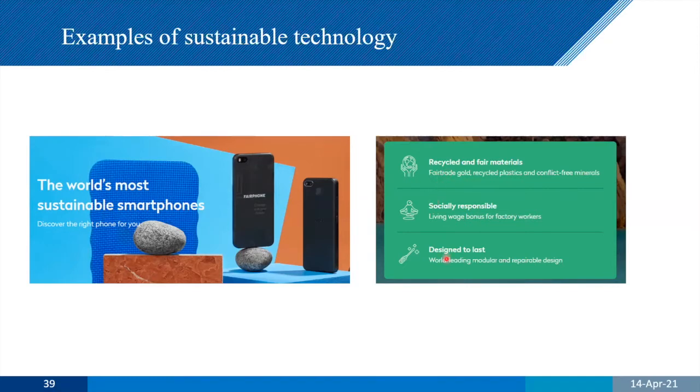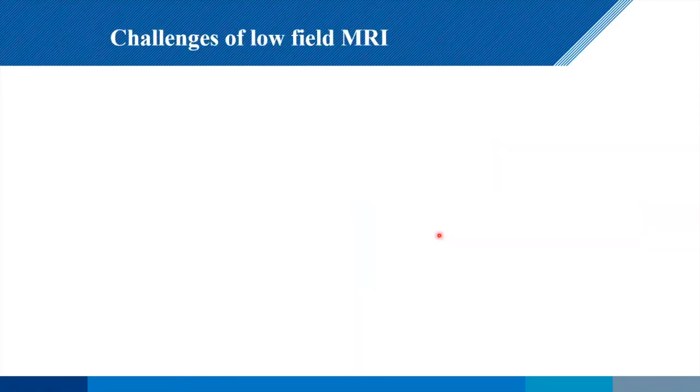But it's designed to last. In other words, it's modular and it's repairable. So as we start to design our system, we want to do the same thing. When a system is in Uganda, is in Malawi, and it breaks, it can't just sit there. That's what 95% of donated medical equipment does. It sits there because nobody can fix it. So we need to be able to train people to be able to fix what we send.